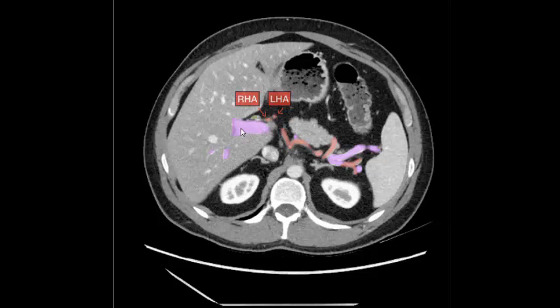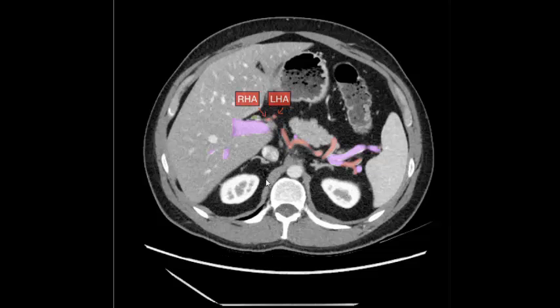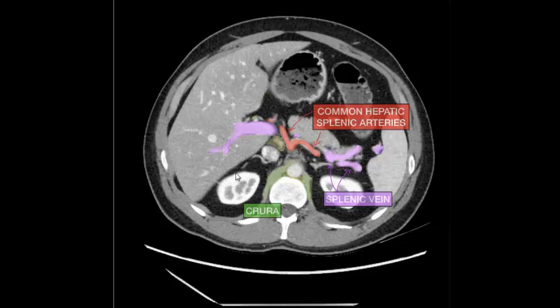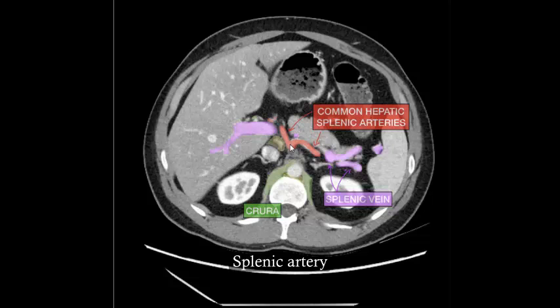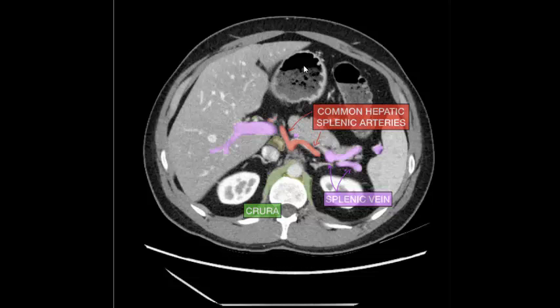Portal vein, right hepatic artery, left hepatic artery, inferior vena cava, splenic artery, splenic vein, right and left kidney, inferior vena cava, abdominal aorta. Transverse colon, stomach, main portal vein, common hepatic artery, splenic artery, splenic vein, crus of diaphragm, right and left kidney, inferior vena cava, abdominal aorta, stomach, transverse colon.